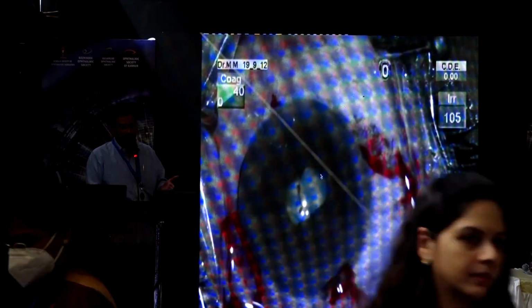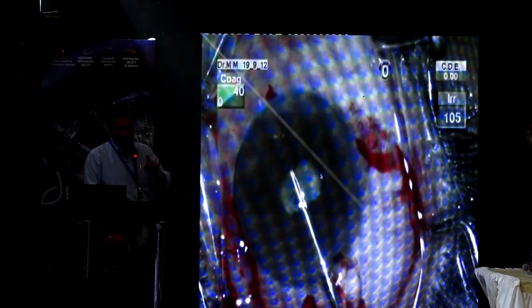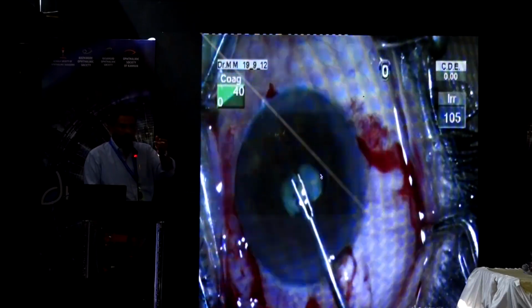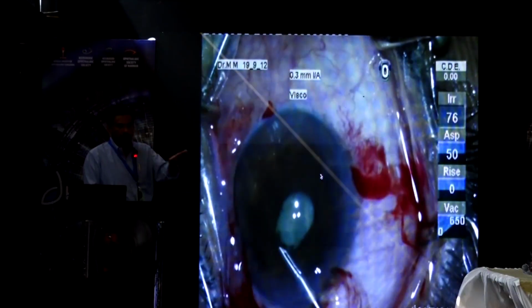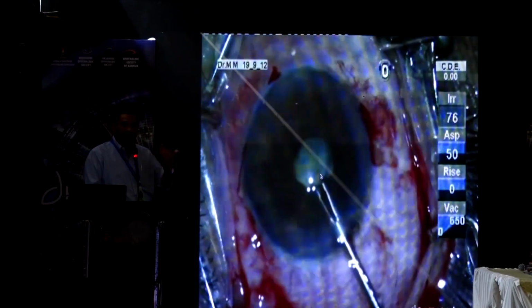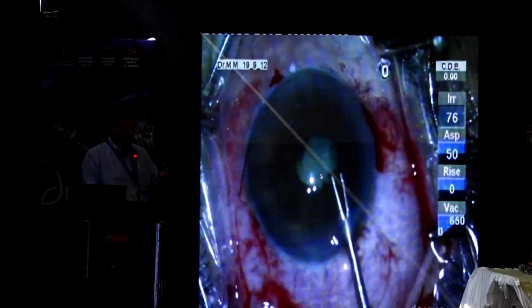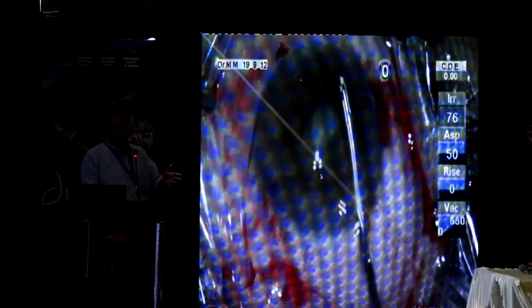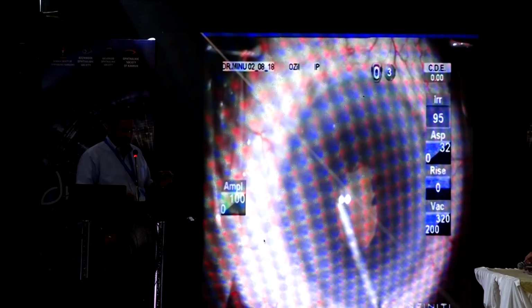Don't put HPMC and then try to stain. If you want to stain after putting visco, put sodium hyaluronate and put a little bit of saline on top of the capsule, then put blue drop by drop, and then paint. Move the cannula over the capsule so that it can paint. Or take out all the visco which you have put, with the Simcoe or IA or whatever, and then put air and put blue.